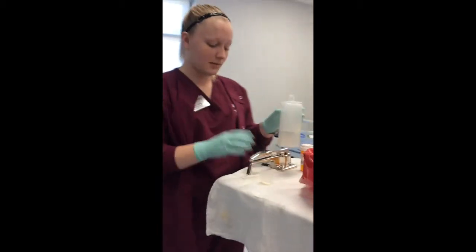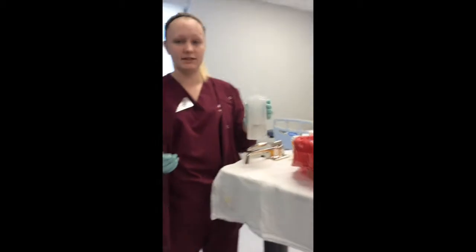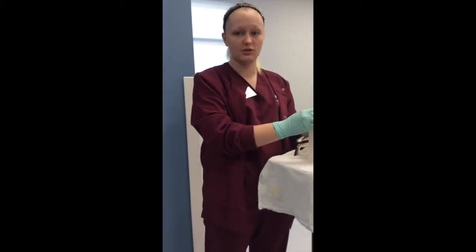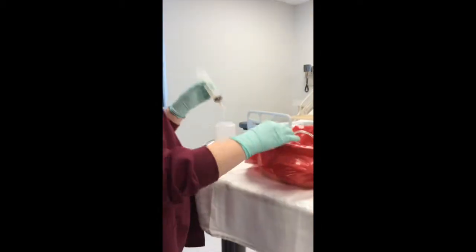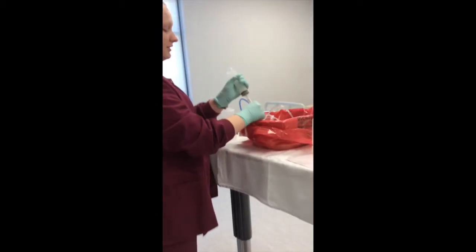Alrighty, and then before I'm going to administer this medication, since this is a feeding tube, I need to go ahead and check gastric residual volume. So I'm going to go ahead and unclamp this from the feeding. I'm going to check residual volume.